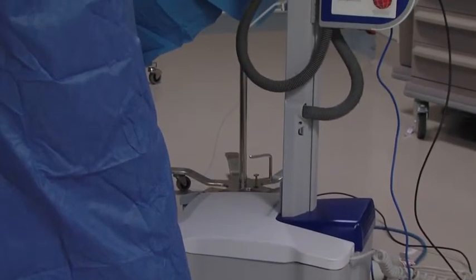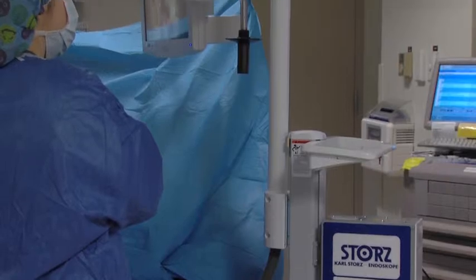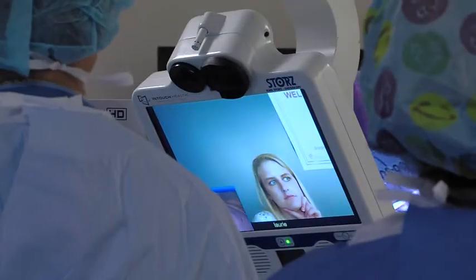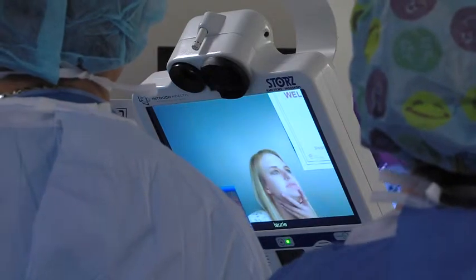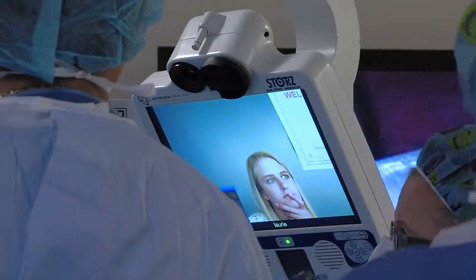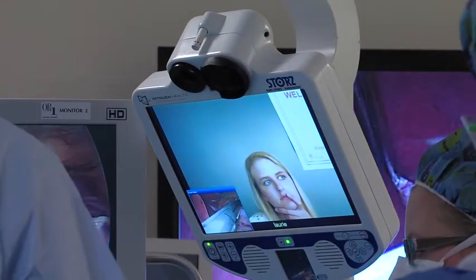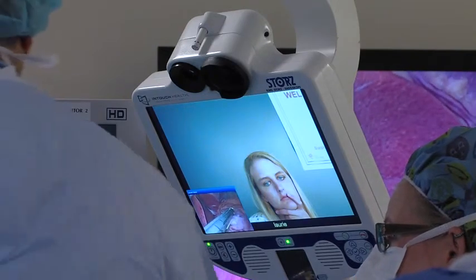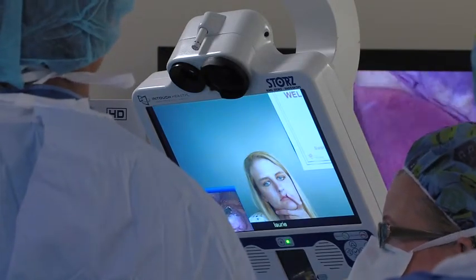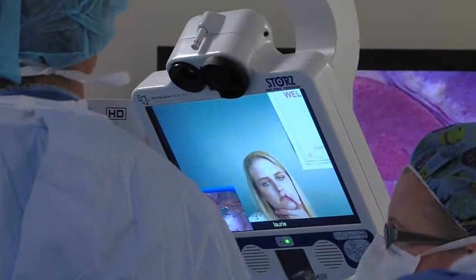The new robot looks like a parking meter with a small screen on a pole that moves up and down. The high-definition two-way communication system allows viewers to see through a laptop and control the view outside of the operative field. Now, what's different about this as opposed to, say, two-way telephone communication is that remotely the surgeon on the other end or the conference center can control what they see.